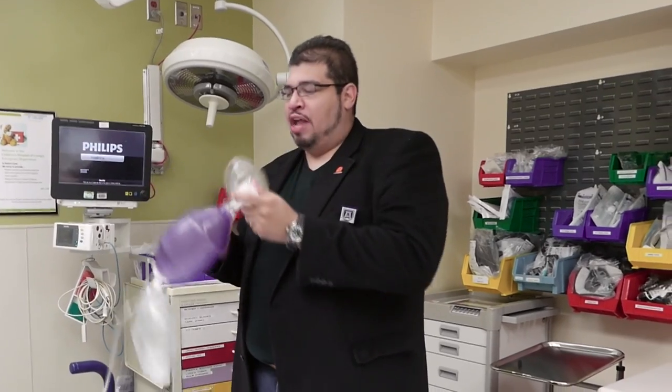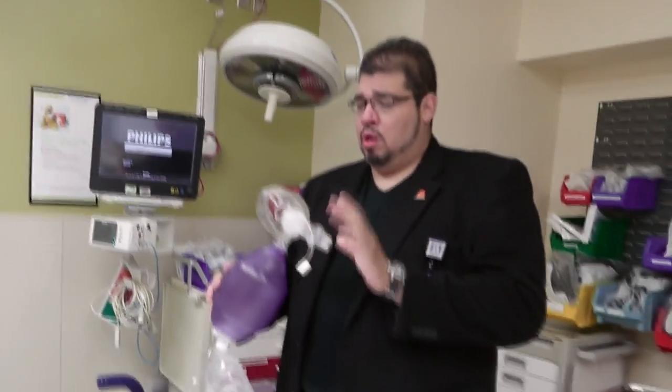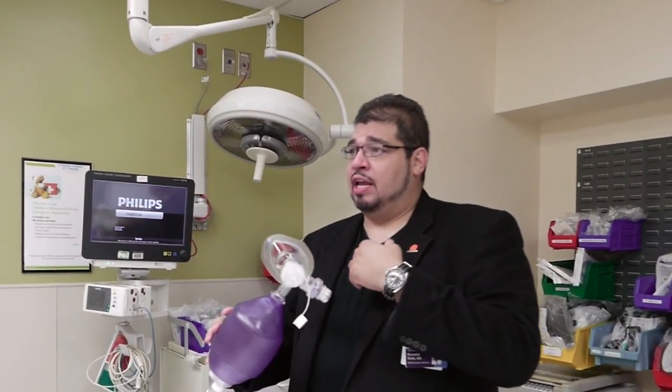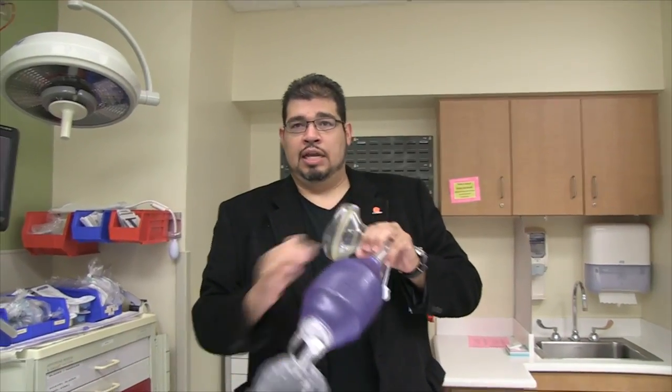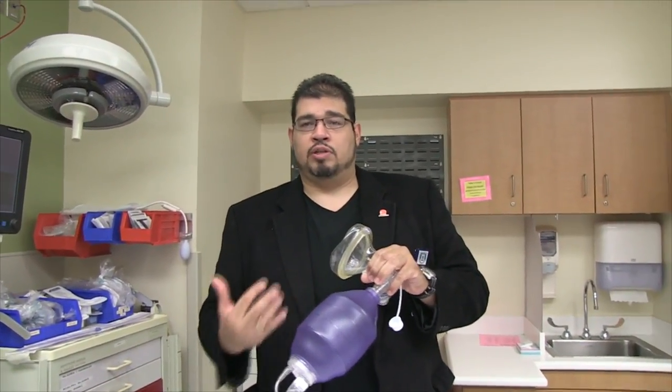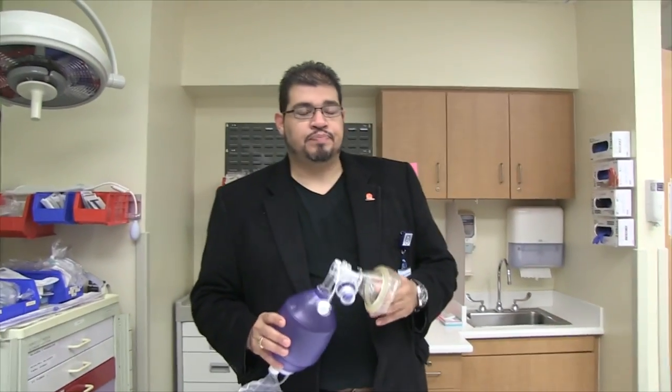Yeah. And so, you can't feel it, but I can. At that liter flow, with the PEEP valve, I'm actually feeling some pressure at the end of each breath. So it's not only just liter flow, it's also providing some positive pressure, you know, through the valve. So I agree that this is a better device.